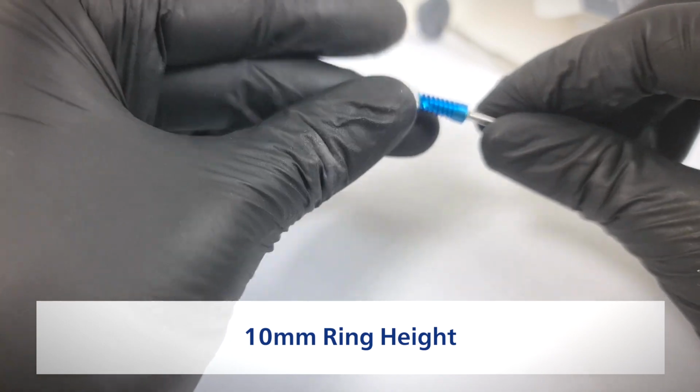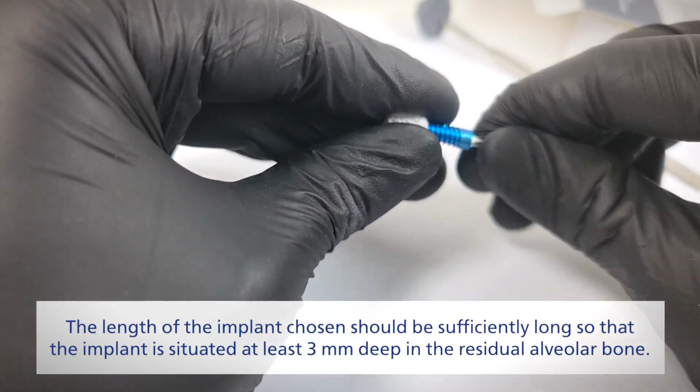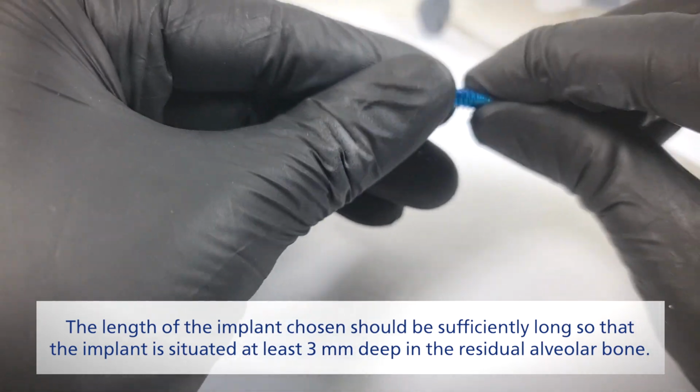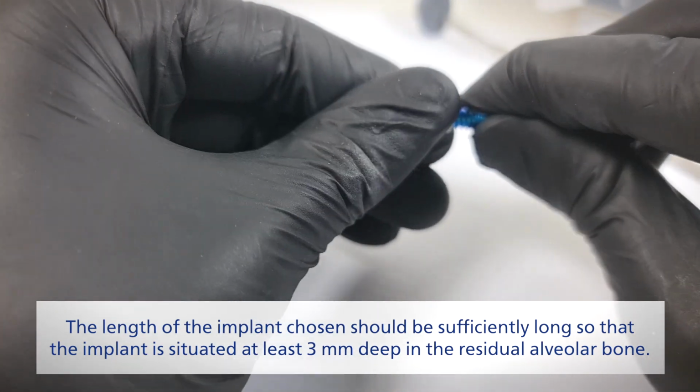The ring height is 10 mm. The length of the implant chosen should be sufficiently long so that the implant is situated at least 3 mm deep in the residual bone.